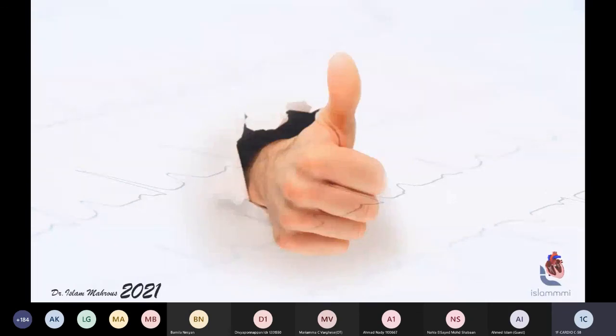So I would like at the end of this presentation to thank all of you. The most important rhythms that you can have in the exam during the ACLS will be asystole, ventricular tachycardia, ventricular fibrillation, because they will give you what we call a mega code, starting with seeing the rhythm. So if you are not able to know the difference between ventricular fibrillation, ventricular tachycardia, asystole, or atrial fibrillation, you will not be able to deal with the case in the ACLS exam, because your answer will always be based on identifying the cardiac rhythm.